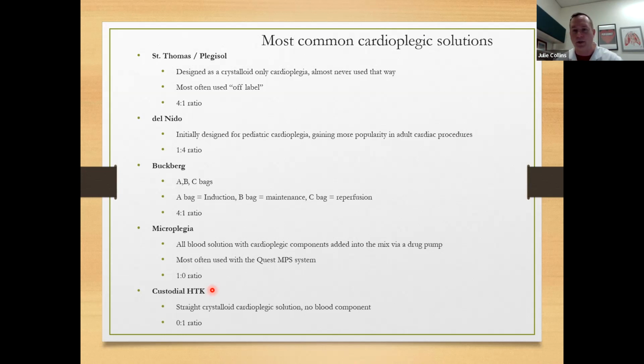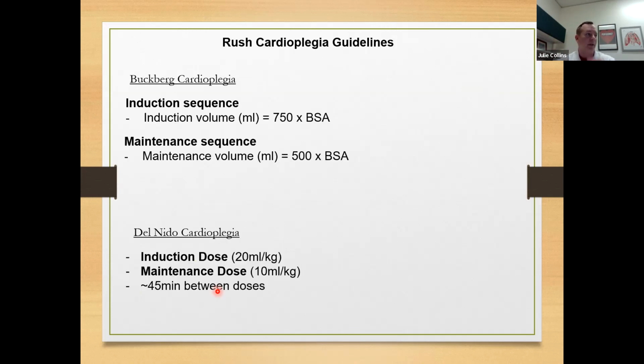So clearly you've got to start hemoconcentrating to get the volume off. But it plummets the sodiums. And to me, that's a little dangerous, especially for neurologic outcomes. Apparently, there are plenty of studies that show that it's okay, but I get nervous when sodiums go that low. So I'm not a big fan of custodiol HTK. I've never used it, but everything I know about it would scare me to use it.